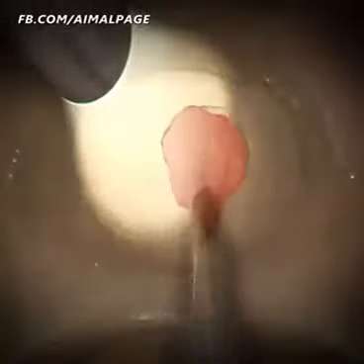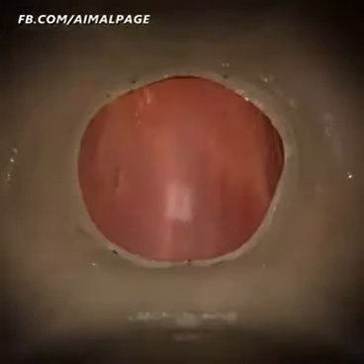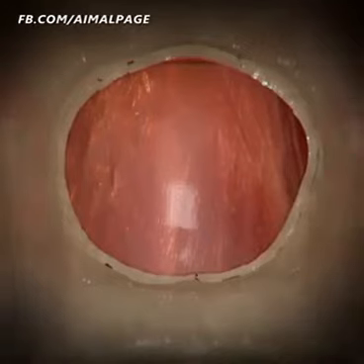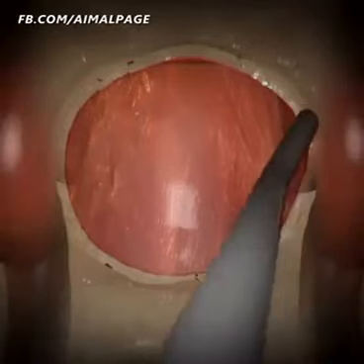Next, the bone of the skull base over the tumor and pituitary gland is removed. Prior to opening the dura, which covers the pituitary gland and tumor, the Doppler probe is used to precisely localize the carotid arteries.